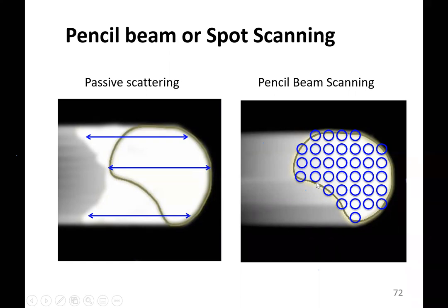Because now pencil beam scanning is using the term, just like IMRT, called IMPT. So it requires more time, because the field is modulating. Sir, but also we are using those compensators. Are they not reducing the dose rate as well? I mean, that is calculated before, when you are doing the planning, in order to make the compensator. So that's done before the planning. But when you are doing the treatment, it is quicker.